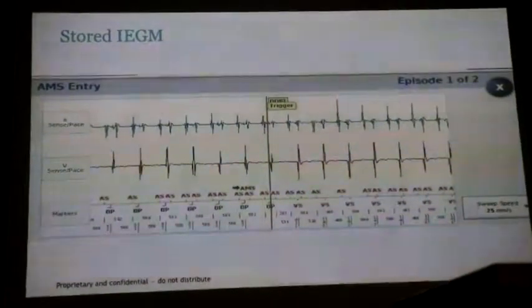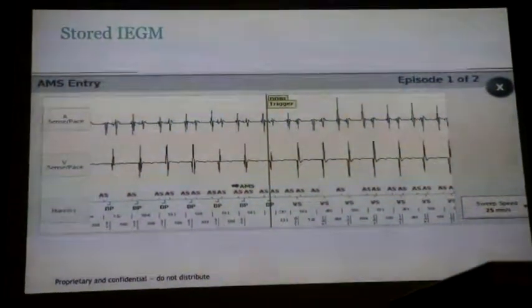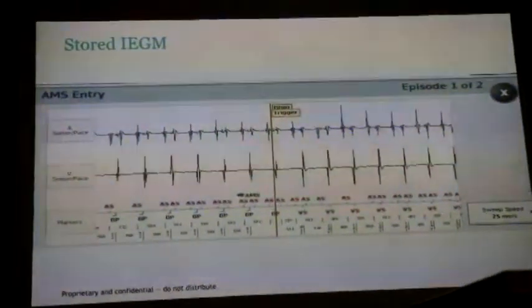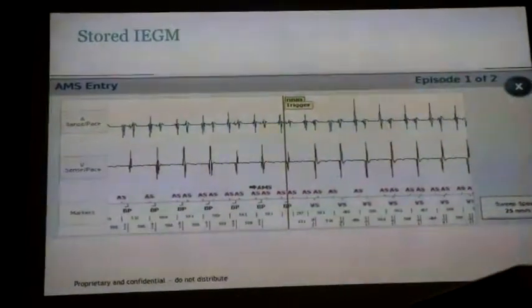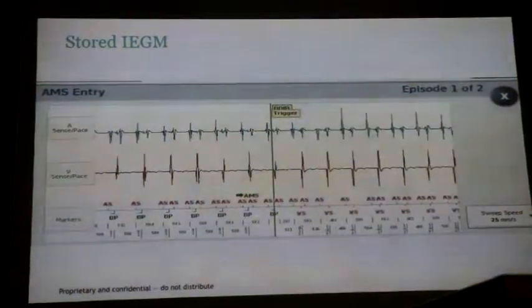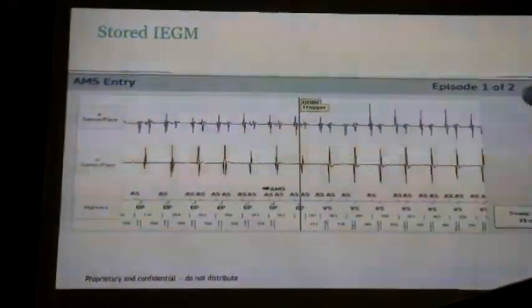You lose bi-V pacing. The device goes to a non-tracking mode. The patient's in sinus rhythm, though, he conducts through his AV node. It doesn't track, right? So now we lose bi-V pacing, and then the baroreceptors maybe are detecting a drop in pressure, so they start to go, okay, drop in pressure, trigger the whole system, trigger things off again. So this patient might have started decompensating as a result of just a far-field R wave, which is insignificant, or we think it's insignificant. We don't pay enough attention to these signals, especially, like Dr. Murdoch said, when you pace.